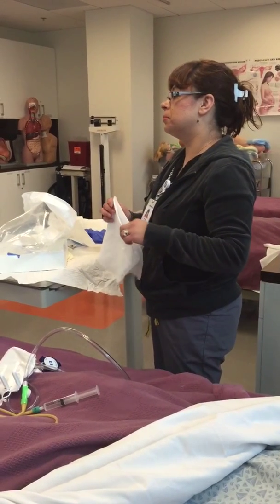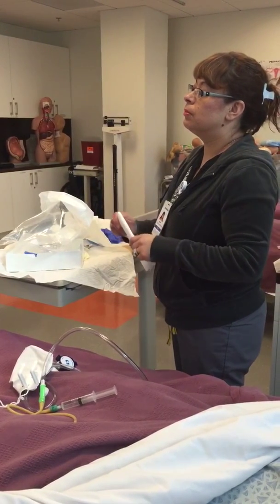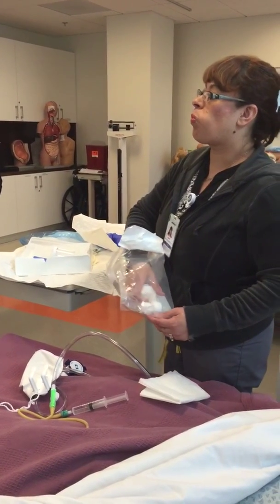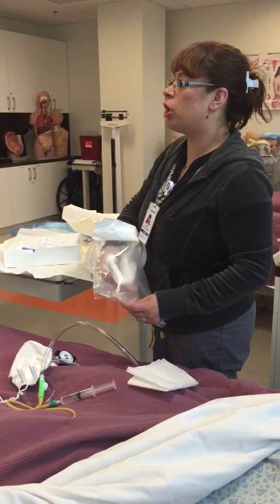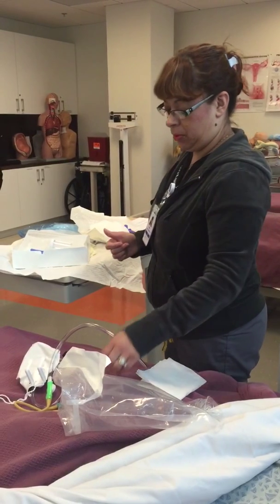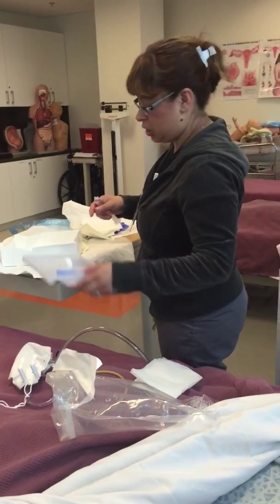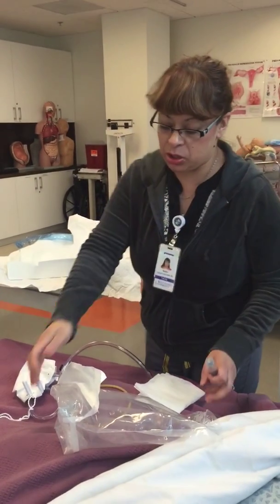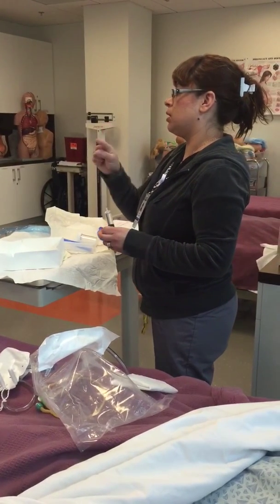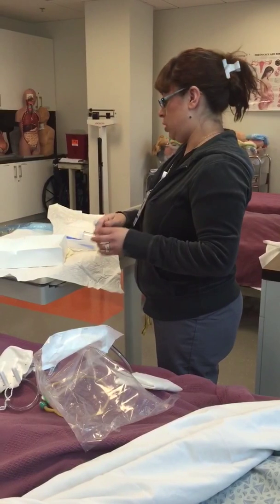Yes. I have a question. I've never done one of these before. I do the regular catheter, the straight catheter. For this one, you said you go in 2 to 3 inches, right? Once urine comes out. Once urine comes out, you're going to advance 1 to 2 inches, because you're not 100% sure that you're all the way in. You might just be at the tip of the urethra and not into the bladder. So you want to make sure. Once you see your urine, you still advance 1 to 2 inches.